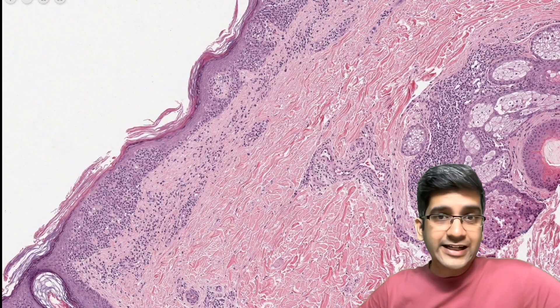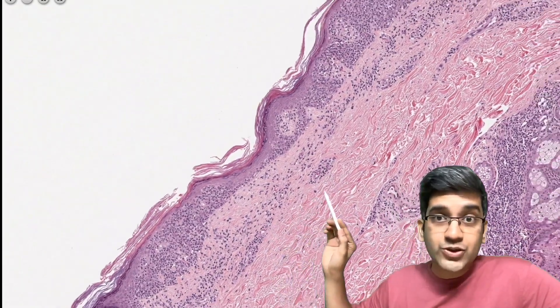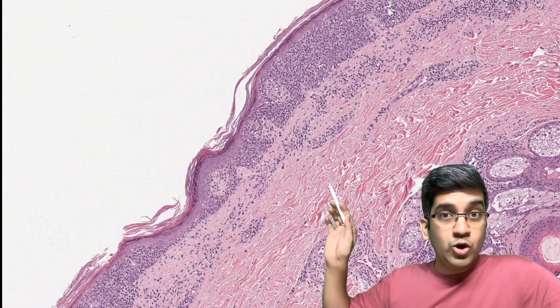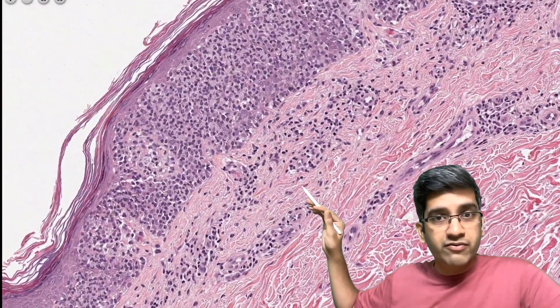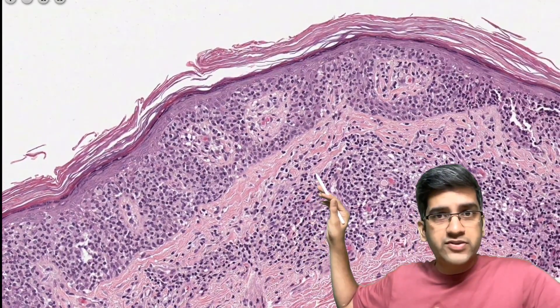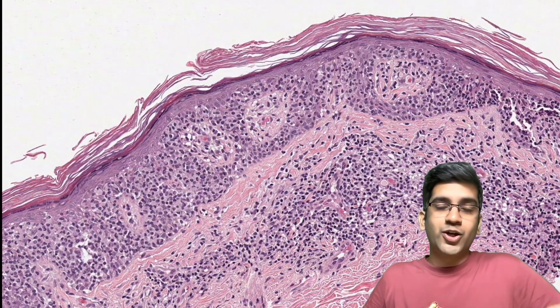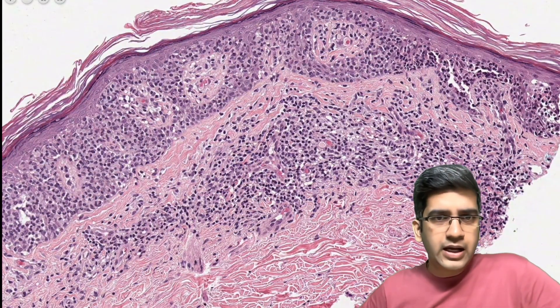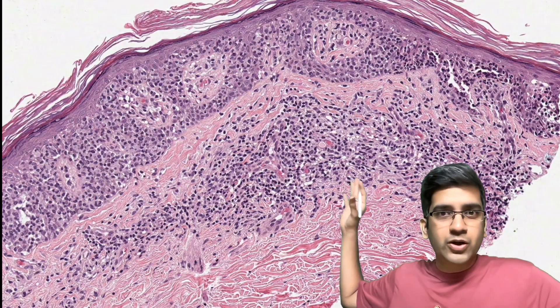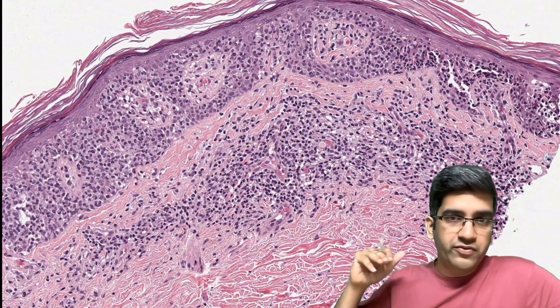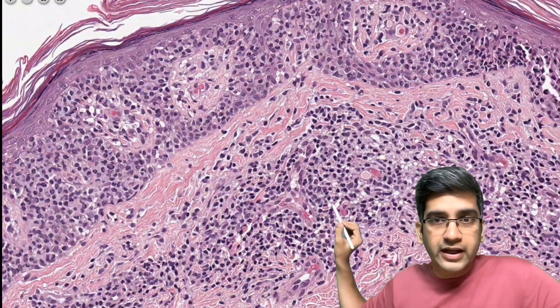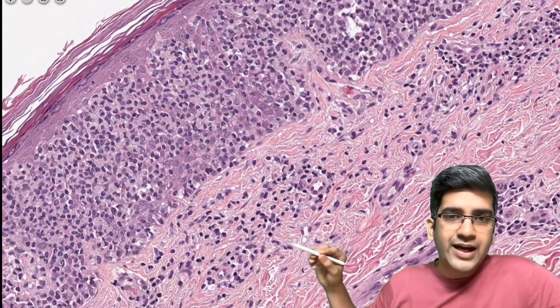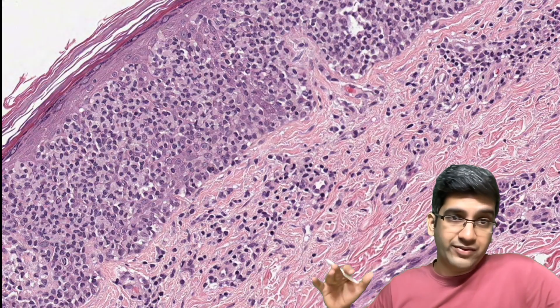At this power I want you to clearly delineate that there is a little bit of fibrotic elements going on. The normal dermal collagen has a very different texture compared to fibrotic areas — there is definitely a dense fibrosis, a superficial dense fibrosis going on here. The inflammatory infiltrate is predominantly a lymphoplasmacytic infiltrate around the perivascular area.